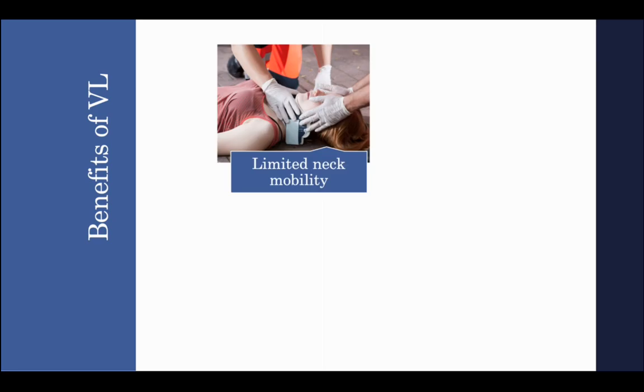Now maybe you have people who aren't sold. If you have providers who are intubating regularly with direct for many years and they're very proficient, try to just add this to your skill set. It doesn't mean you necessarily have to change. If you have a new intubator, you're going to be able to build this skill set a little bit quicker. So there are patients that there's a lot of benefit on.